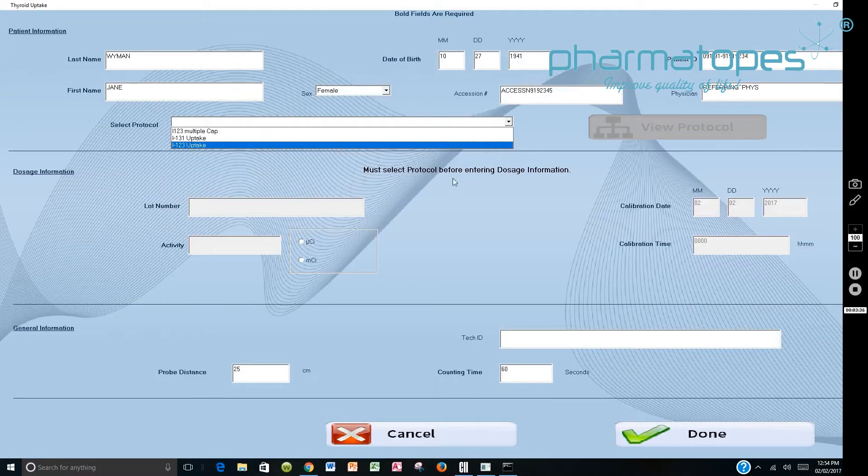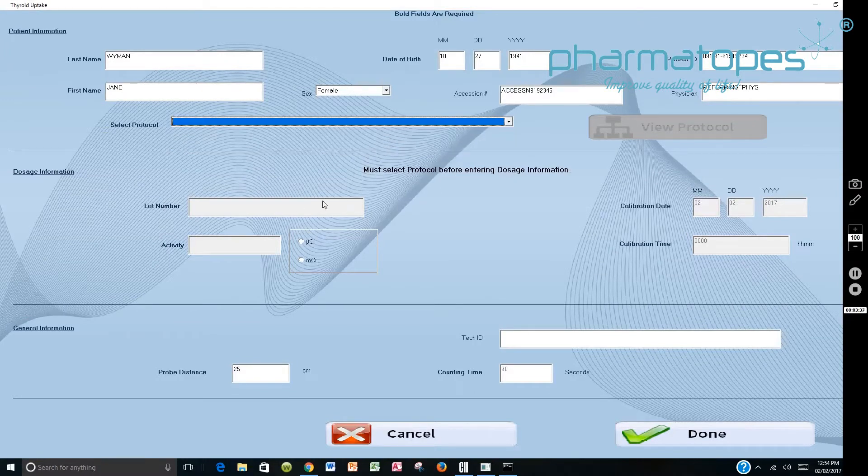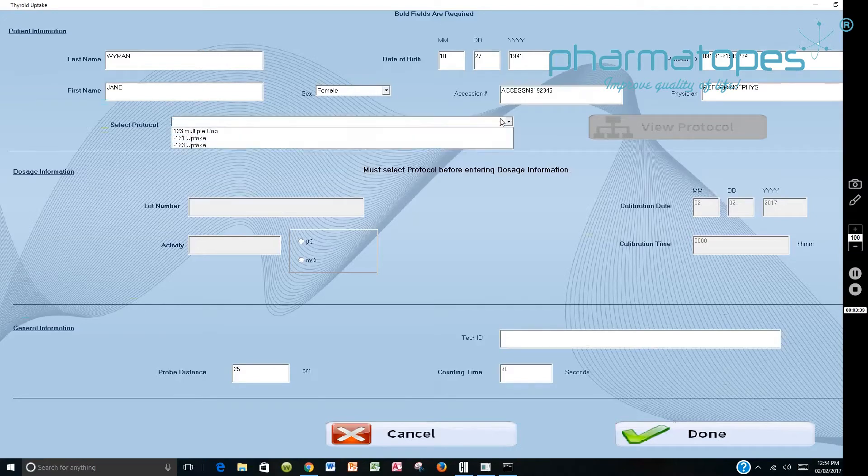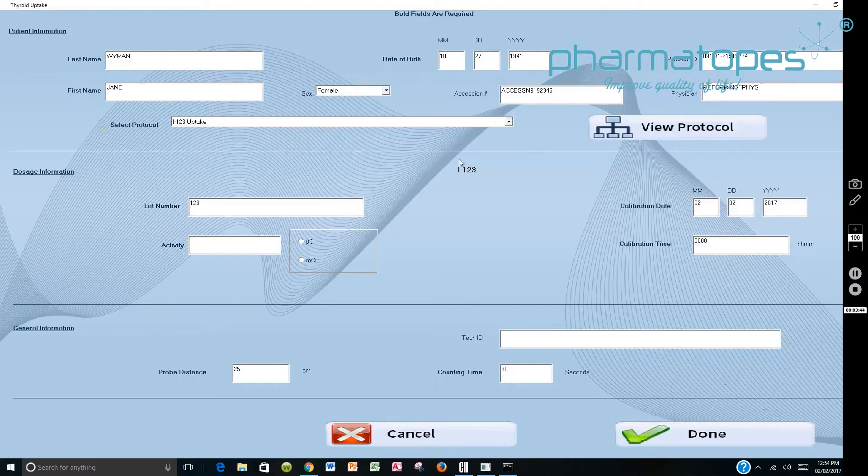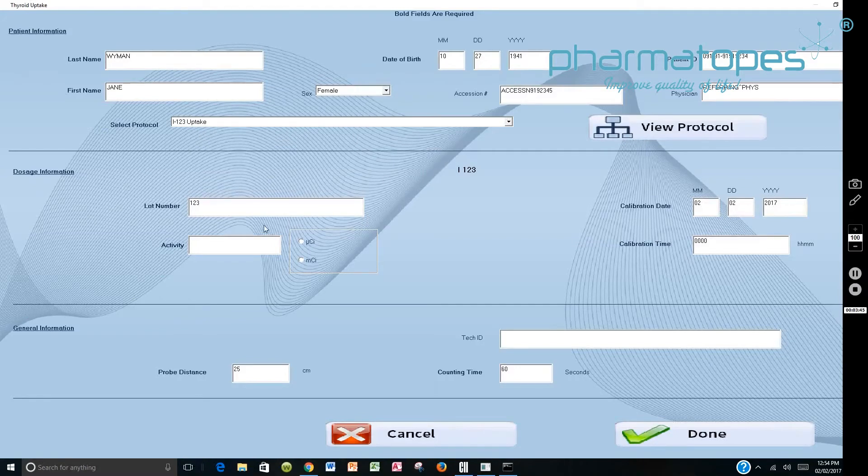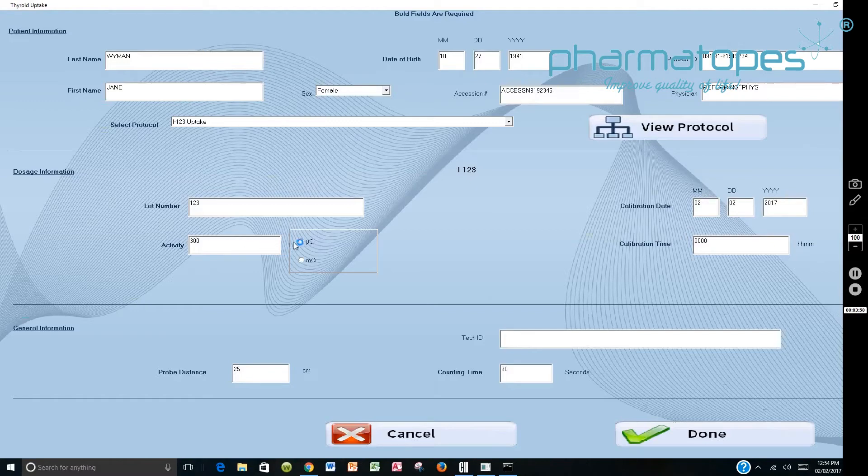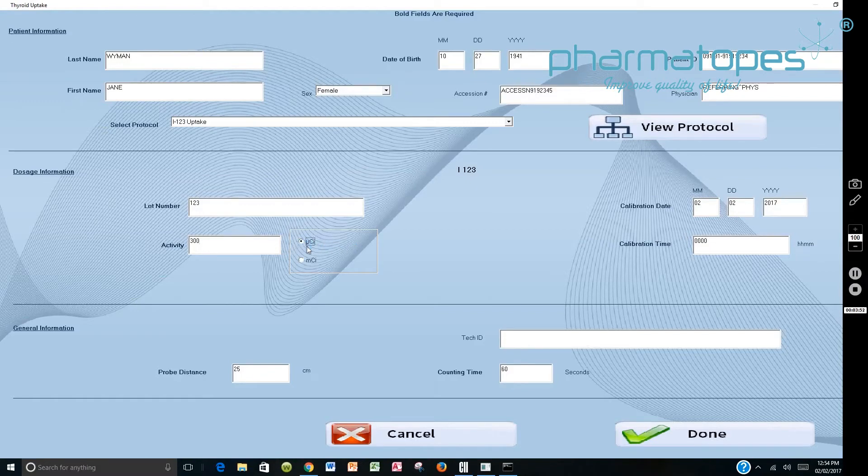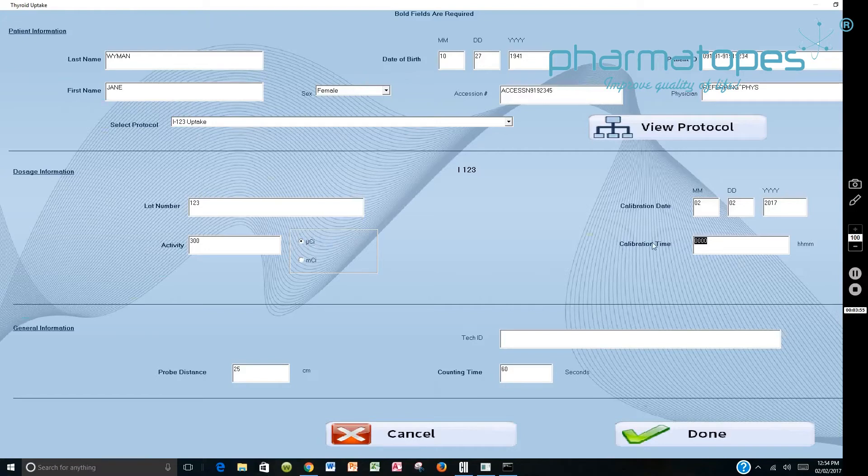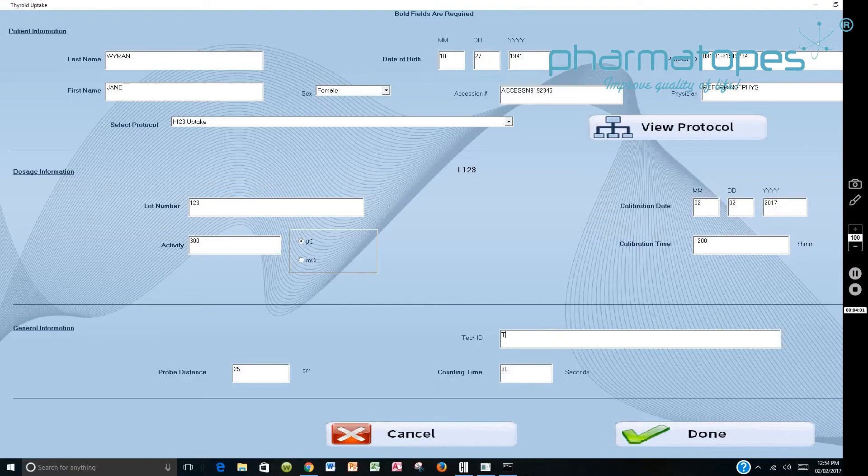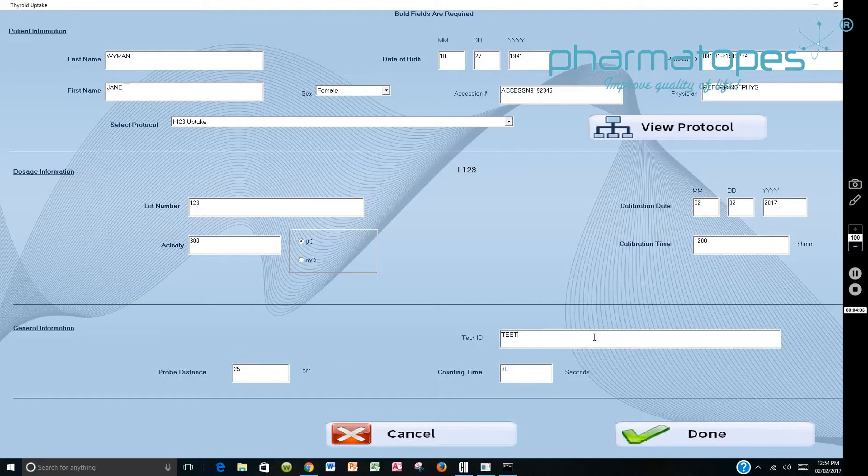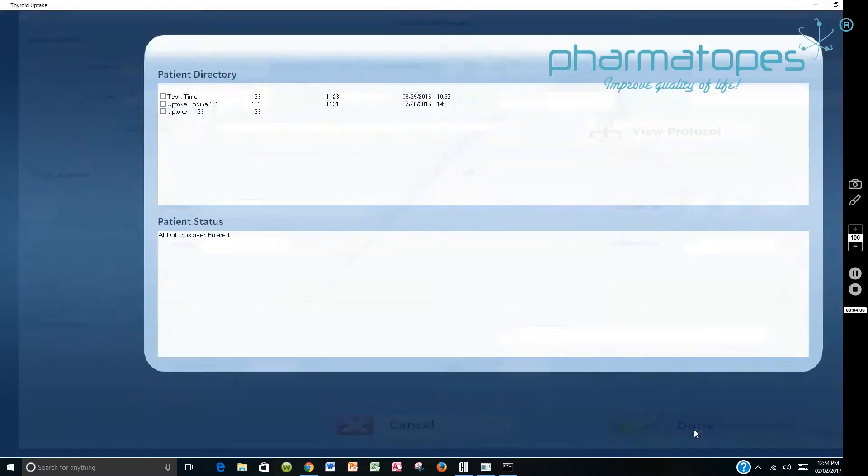Then after we've selected that, we will have to fill in with the lot number from the dose, the activity. In this case we'll say 300 microcuries as of 12 noon today. So we'll change this time and put in 1200. And then we'll put in the name of the person performing this. In this case I'm going to put test in there. Review your probe distance and your counting time here. And once that's done, you can say done.